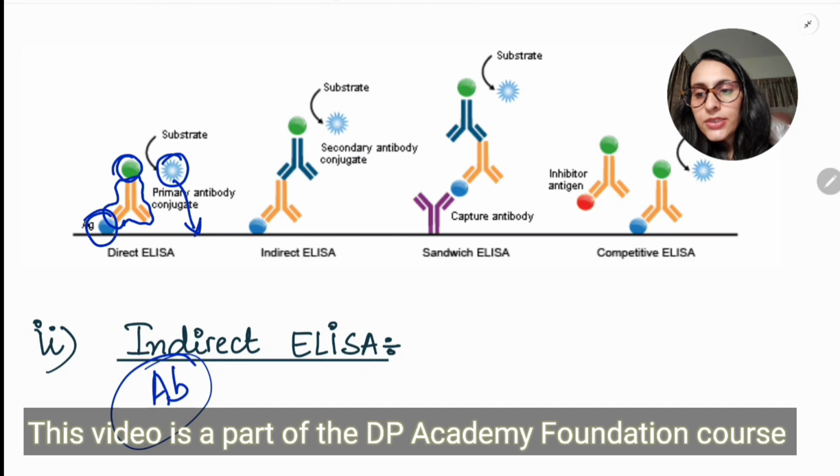Indirect ELISA is the one where antigen is present on the tray, and antibody is taken from the patient sample. It is done for antibody detection. So we are taking antibody from the patient here.